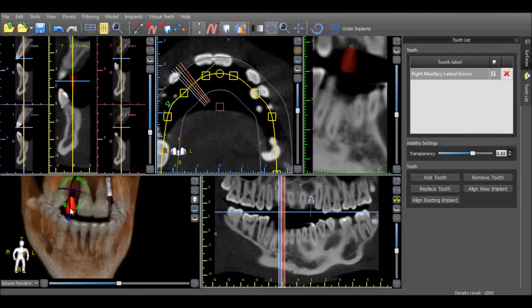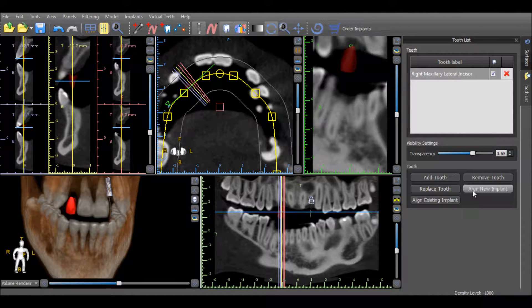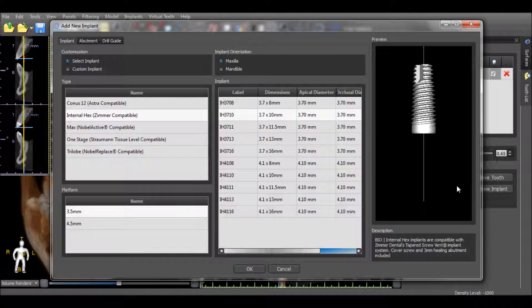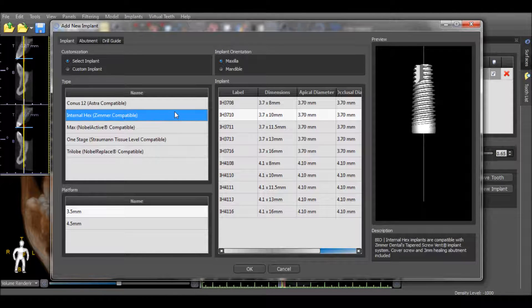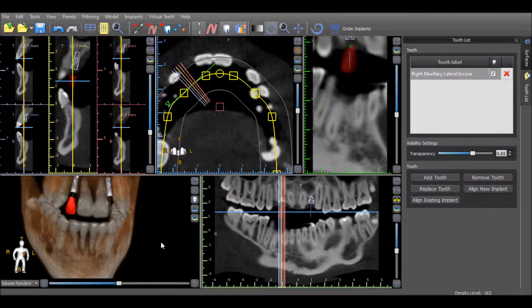An implant can be aligned according to the positioning of the virtual tooth by pressing Align New Implant. The implant type should be selected and then press OK. The software will position the implant based on the positioning of the virtual tooth. Of course, the positioning of the implant can then be further optimized if desired.